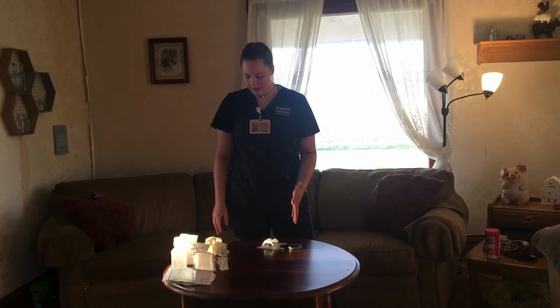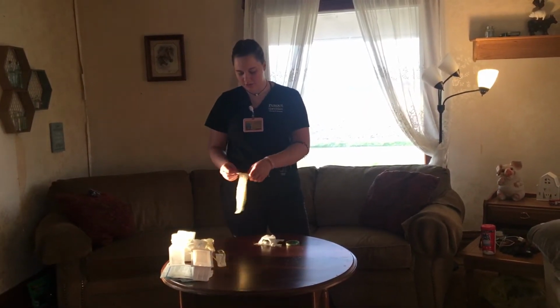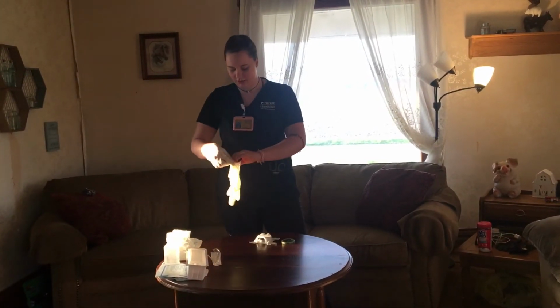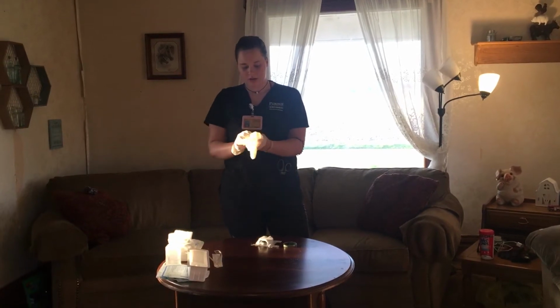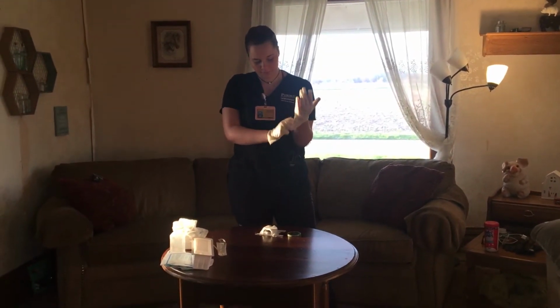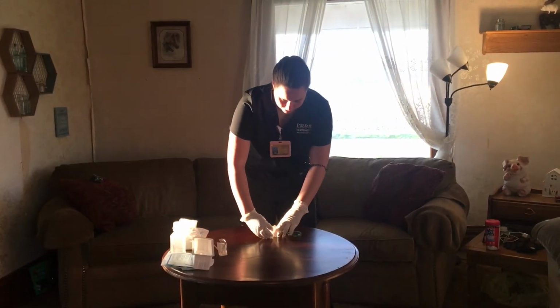So we've already done all that. So we've already performed hand hygiene. So we're going to remove the old dressing. So we're going to put on just regular clean gloves. And we're going to remove the dressing. So you want to use a push-pull method so you don't tear their skin.